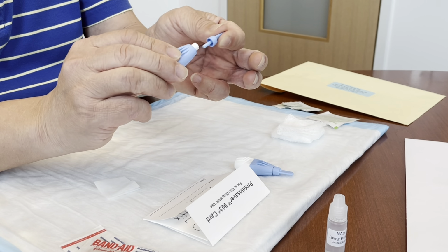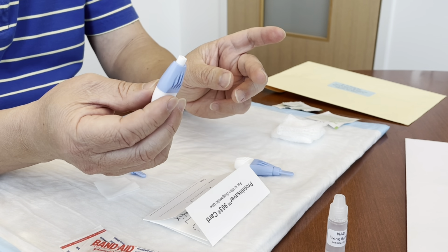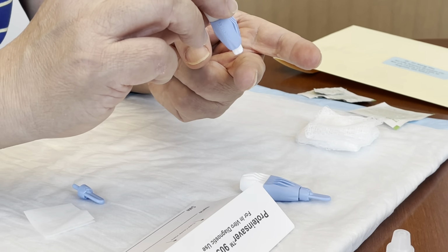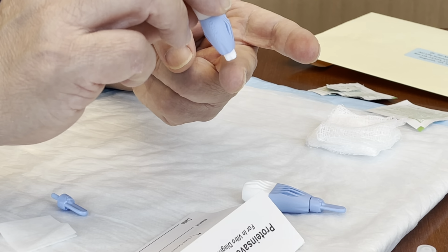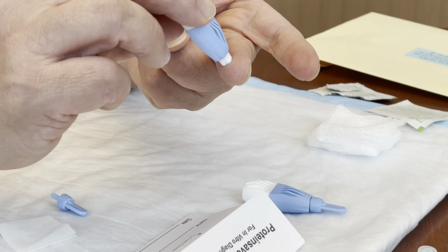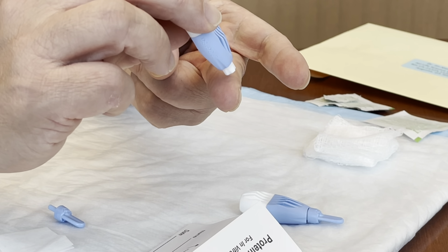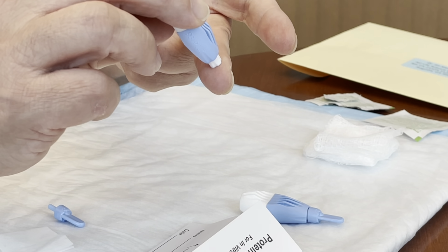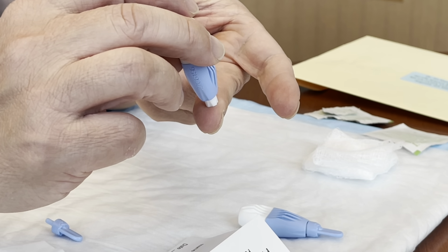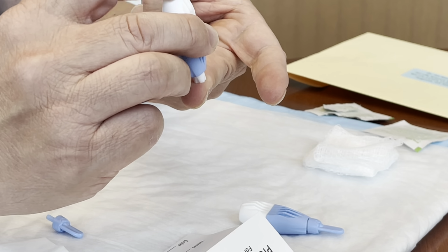Twist the cap off the lancet and place the lancet tip against the side of your fingertip. Aim for the side of the fingertip, not the middle of the finger, not the end, not too close to the fingernail, but about midline between the top of the finger and the pad. The lancet is spring activated. Press the lancet hard against your finger. You should hear a click and feel a sharp pinch.